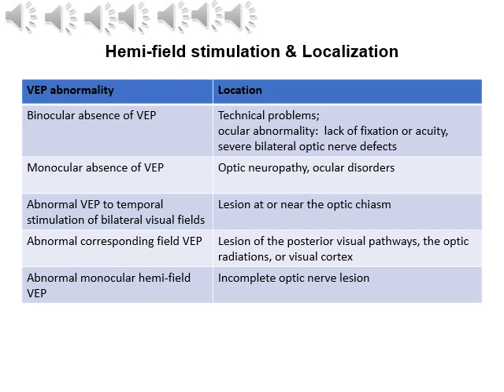And so if we stimulate the right visual fields of either eye and note an abnormal VEP at the right recording electrodes, then we know that there is a lesion in the left post-chiasmal tracts. And the same idea if it were the right optic tracts or the right optic radiations. This pattern of abnormalities of the VEP would suggest a homonymous hemianopsia. This last line corresponds to the number 2 cut that we saw in the previous drawing.